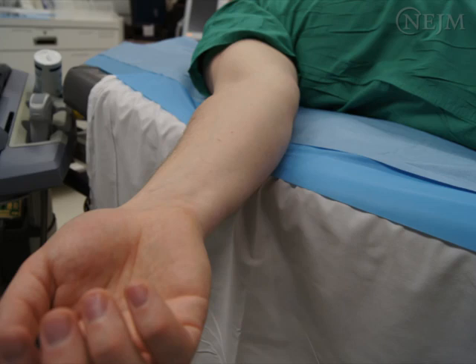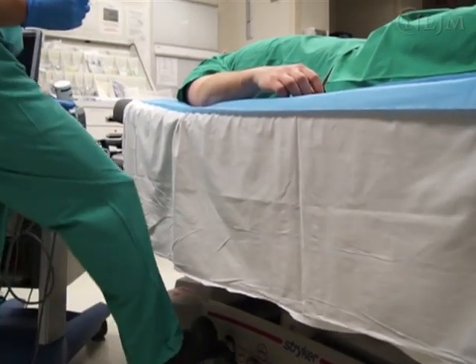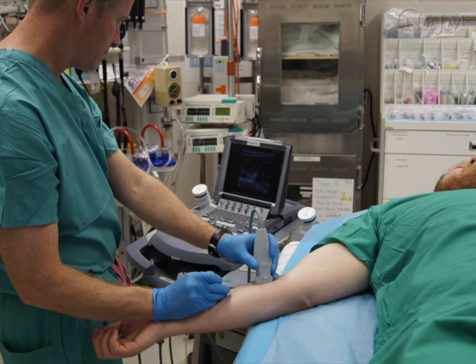It's best to place the arm in a horizontal position so the ultrasound images and needle movements are in the vertical plane. Elevate the bed or sit down so that you are not bending or stooping, but working with your hands comfortably in front of you. Place the monitor so you don't need to turn your head or look over your shoulder to see the ultrasound images.